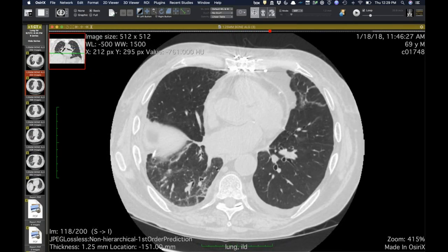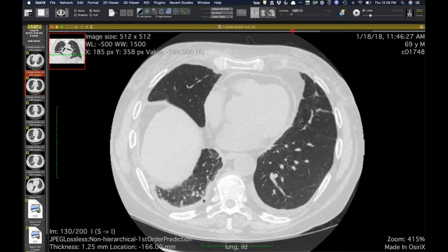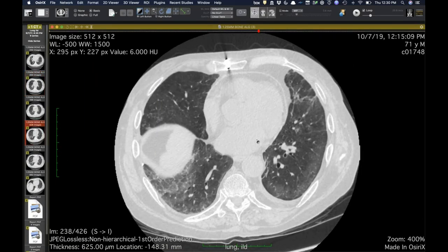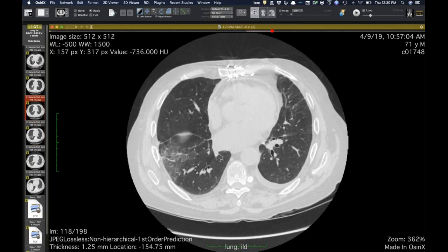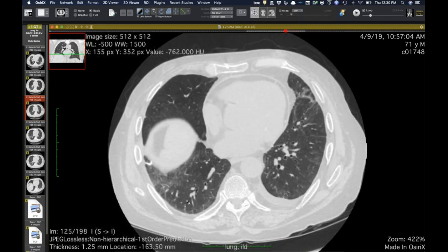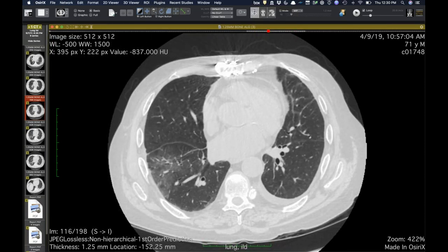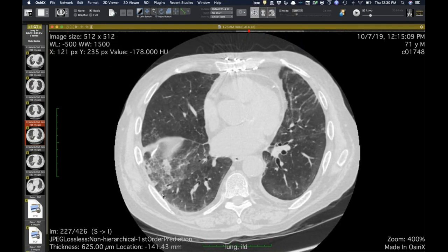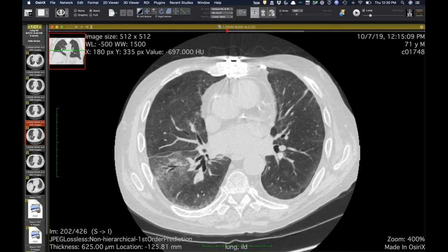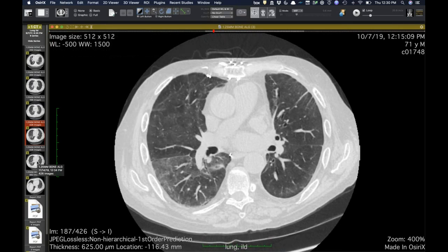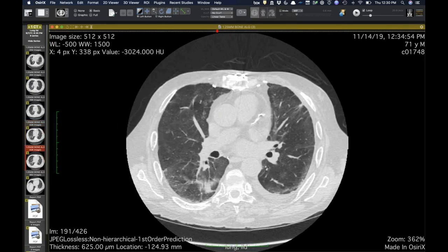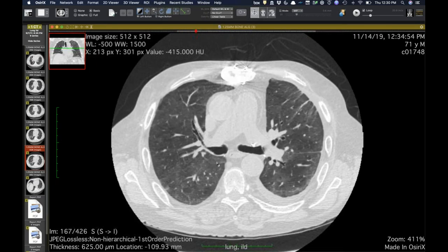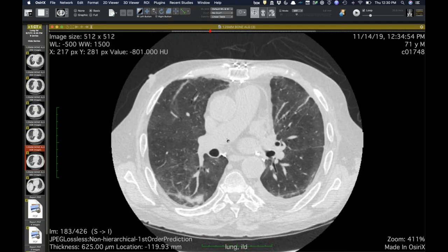This was his first outpatient transplant CT — everything looks reasonable, a little bit of scar and atelectasis. He was doing okay. Then around October of this year, he's got a little bit of ground glass back in April 2019 — not just in the right lower lobe, but a little bit more elsewhere. Worsening ground glass in October, declining PFTs, worsening shortness of breath. Is it rejection? Is it some sort of infection? The bronch was negative, then they did another bronch and transbronchial biopsy.